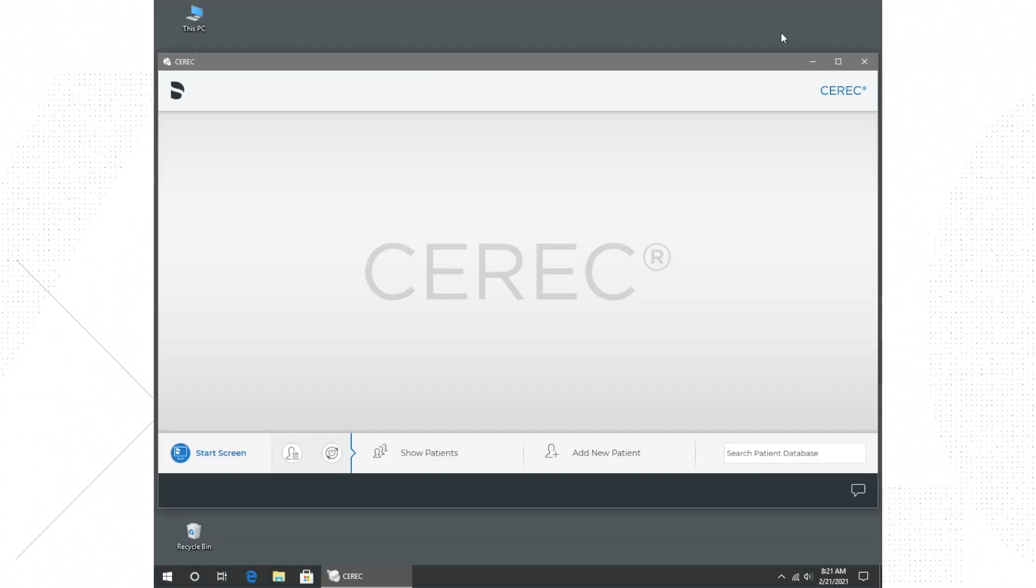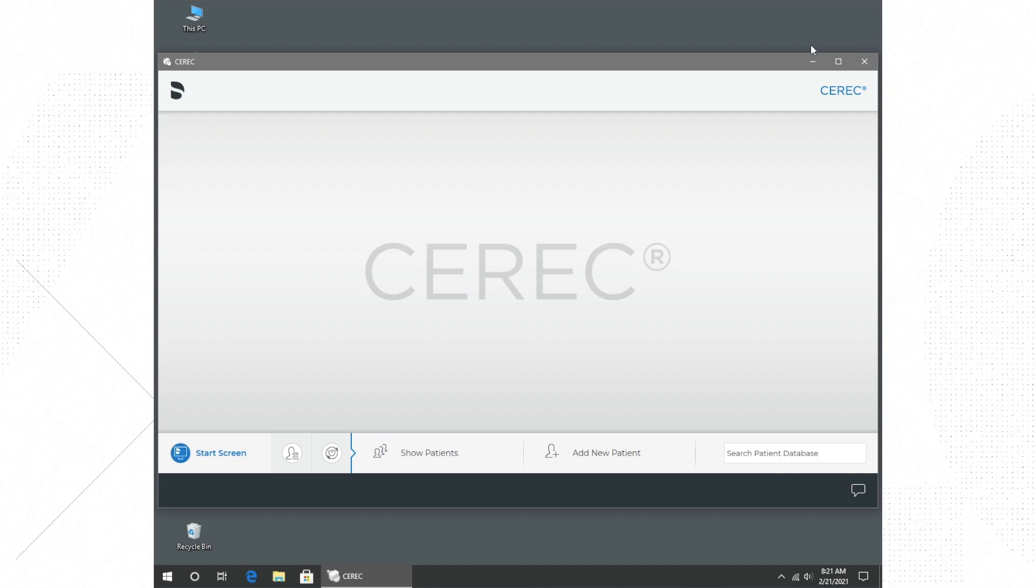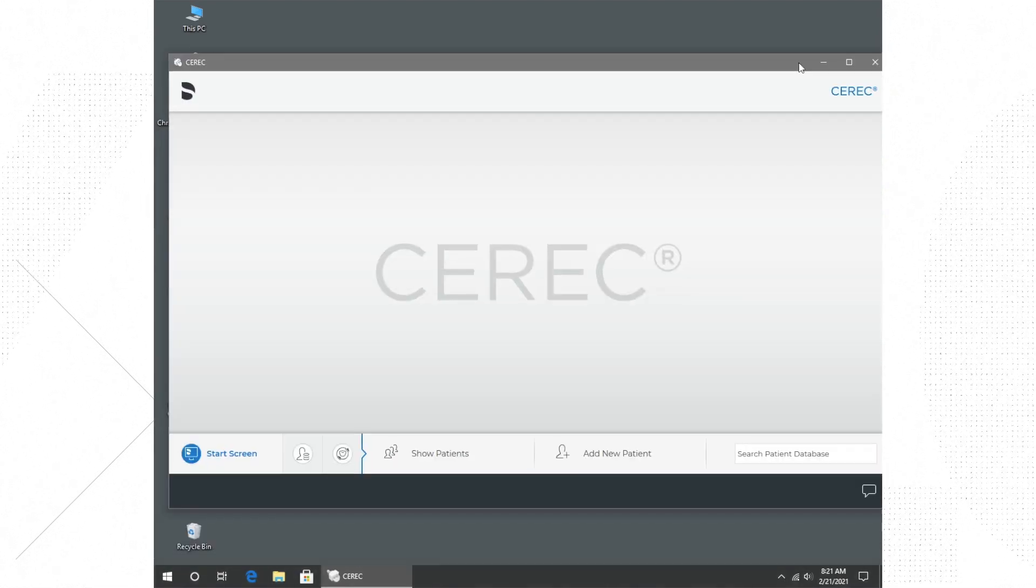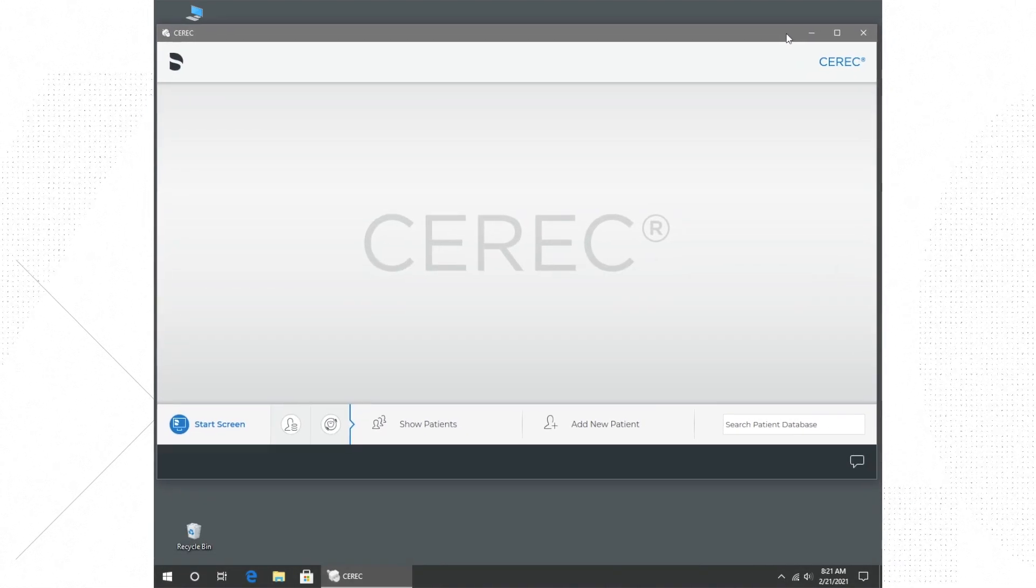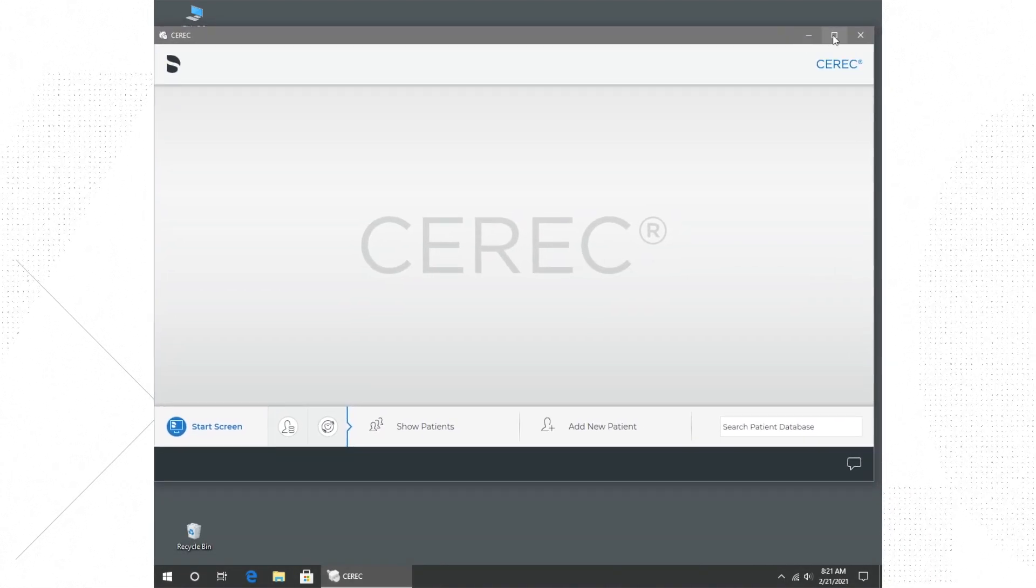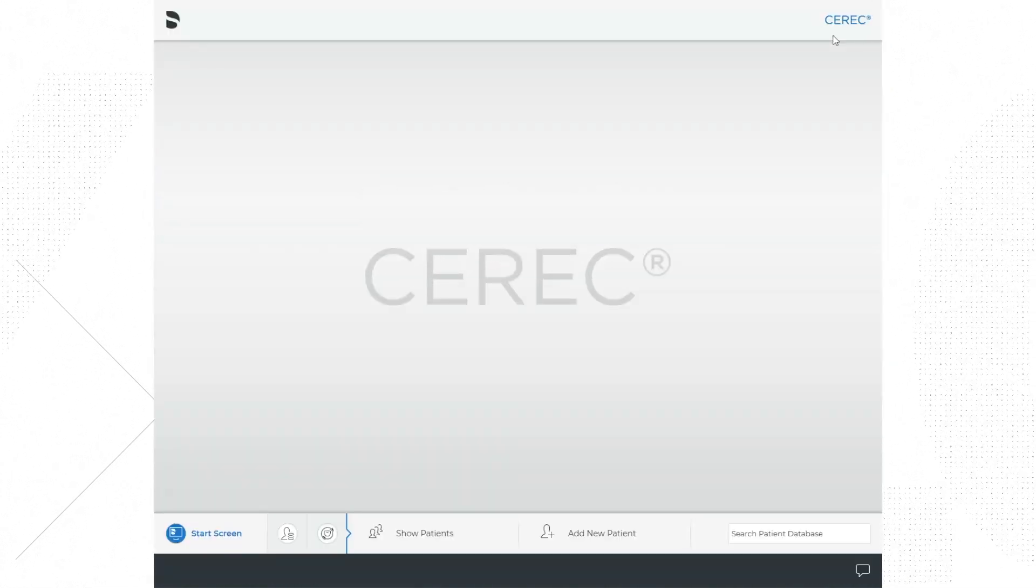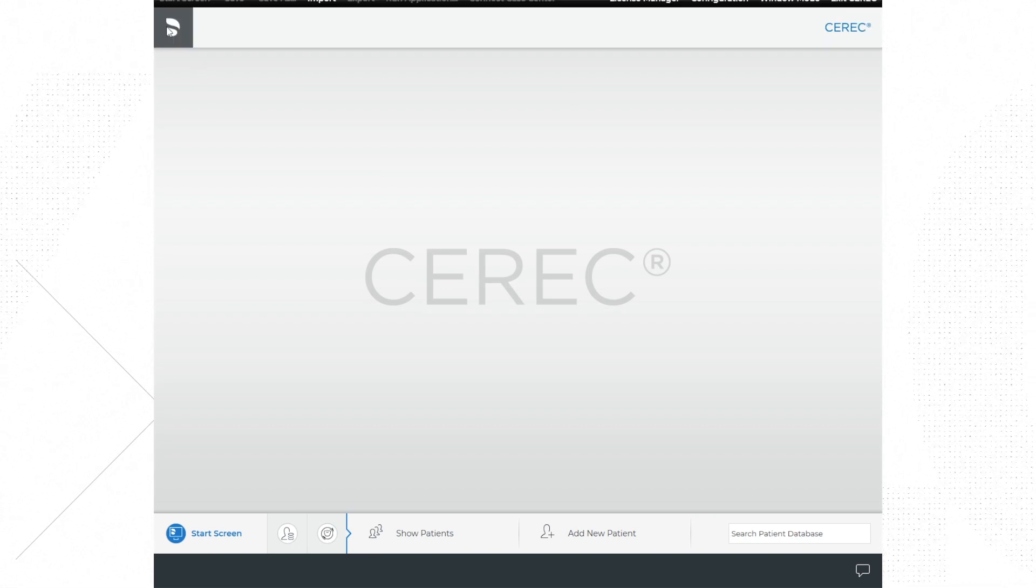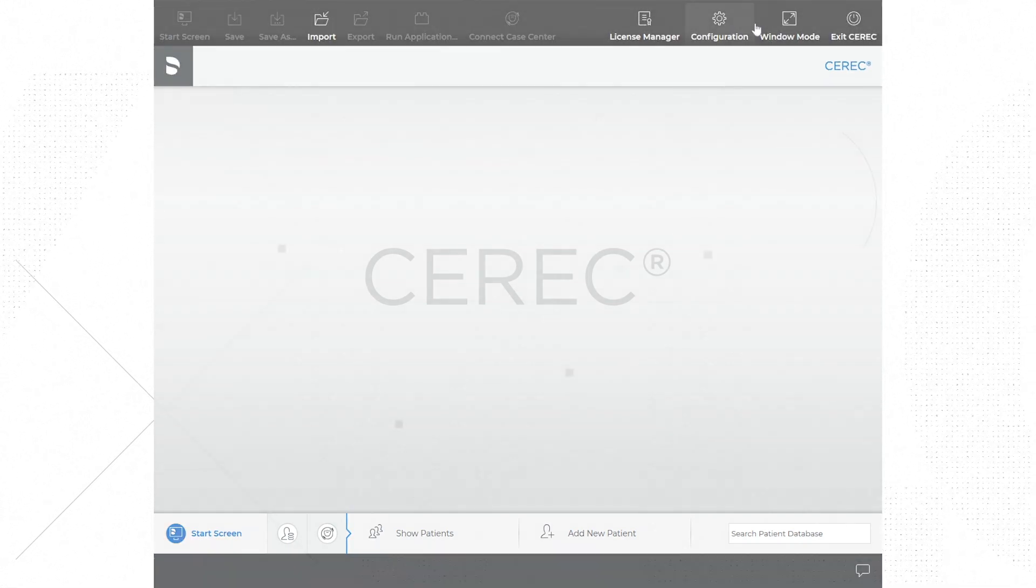One provider can open and start a new case while another provider is milling a separate case. That is the system menu, and this menu can be accessed at any point while you're using the software by clicking on the Dentsply Sirona symbol in the upper left of the screen.